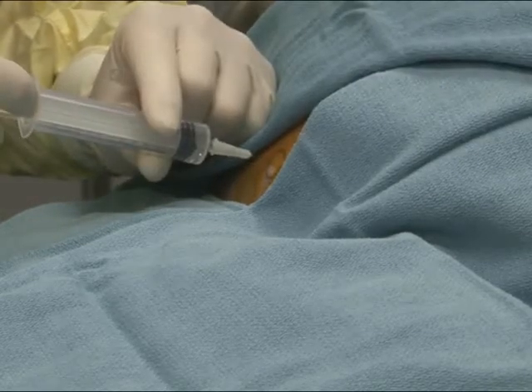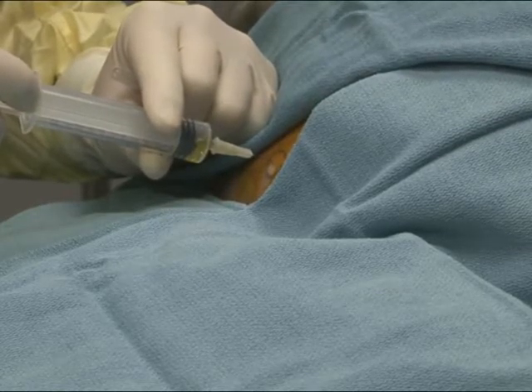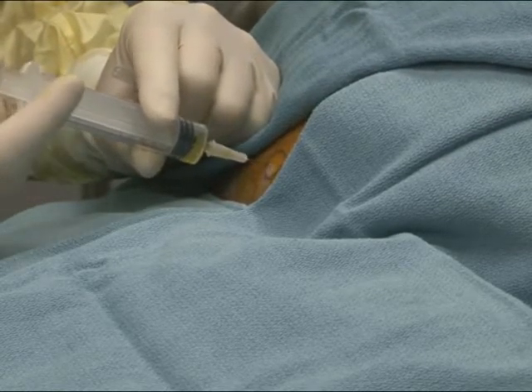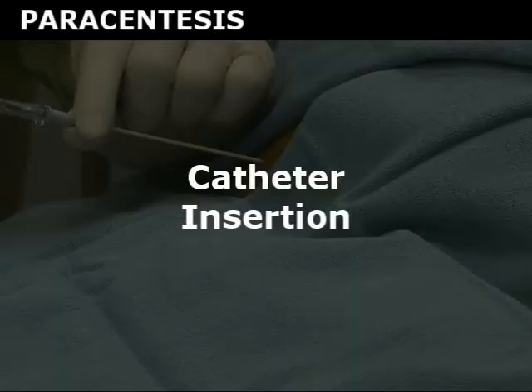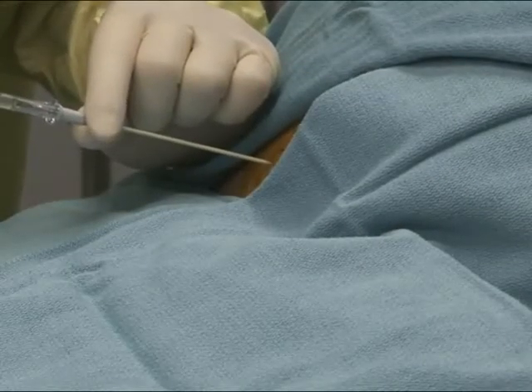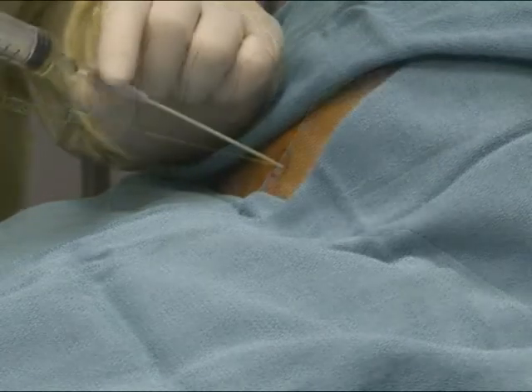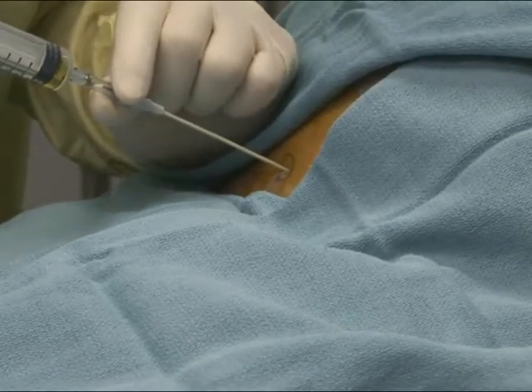Once ascitic fluid is obtained, the needle is withdrawn several millimeters, then inject 1 cc of lidocaine at the margin of the peritoneum to numb the peritoneal layer. Insert the drainage catheter down the exact tract of the block, maintaining suction on the syringe attached to the catheter so that it is clear when the peritoneum is penetrated.